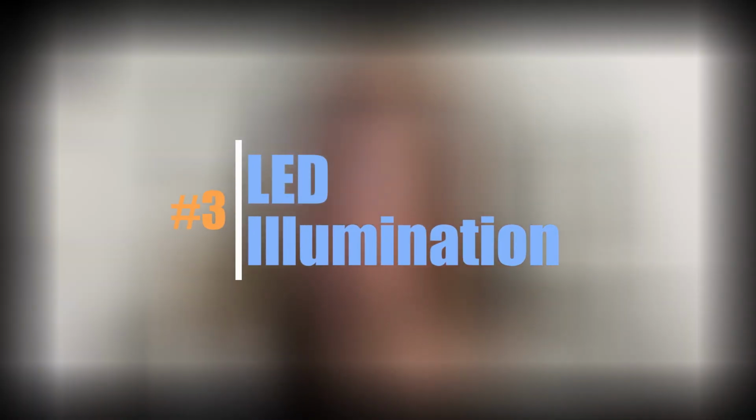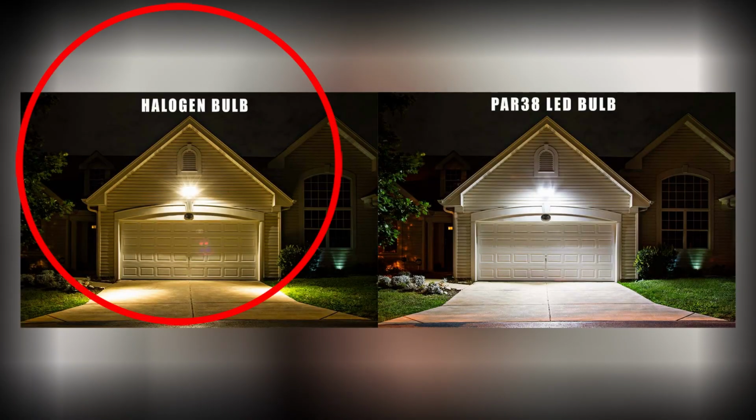Number 3, LED illumination. Most slit lamp biomicroscopes use a halogen lamp. These produce a softer off-white or yellowish light.